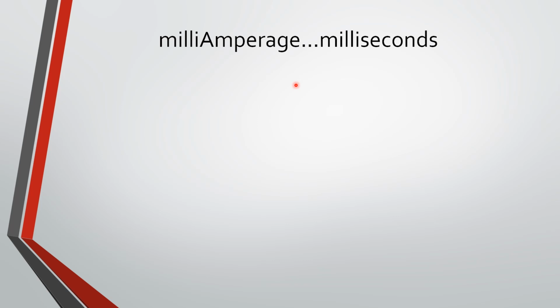So as I mentioned before, I believe it was the 20 milliseconds or 80 milliseconds. It's easier to say 80 milliseconds than it is for us to say 0.08 seconds, okay? They're both the same thing. So we have a possible issue that can occur when we're trying to figure out what the effective mAs is actually going to be, because it may be presented in milliamperage and milliseconds.